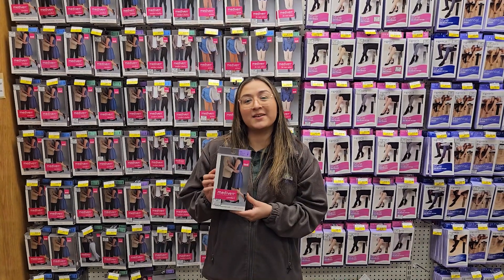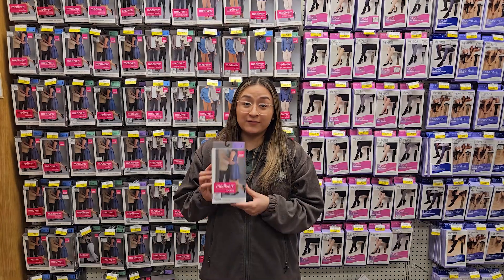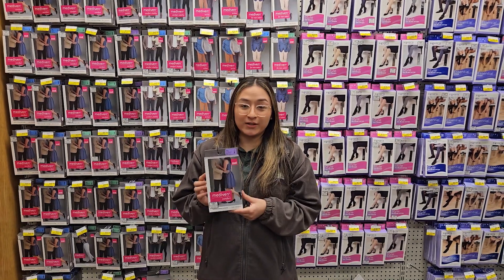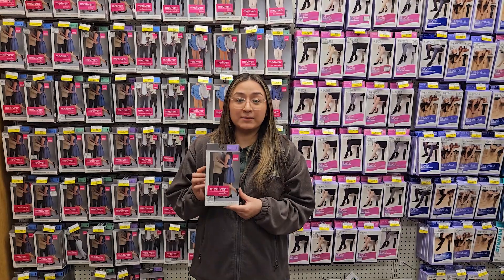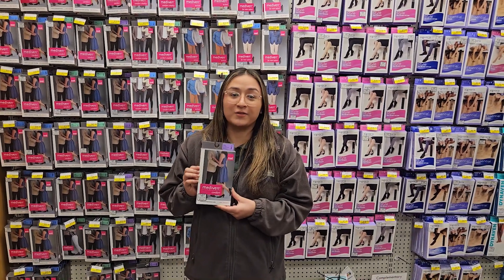Our last level of compression is going to be the 30 to 40. This is going to be significantly tighter than the 20 to 30s, and it's definitely for lymphedema patients. These are the three levels of compression we have available in our store.